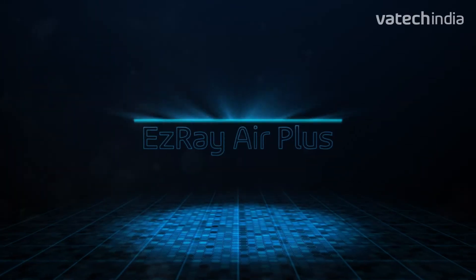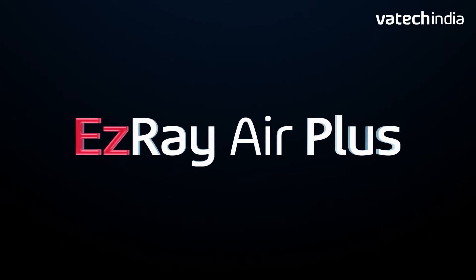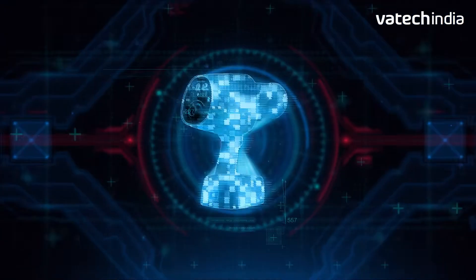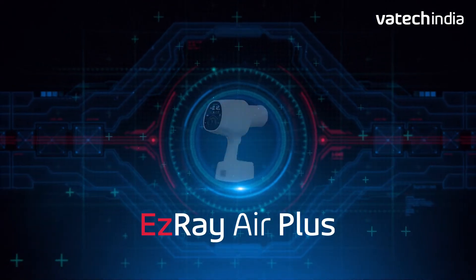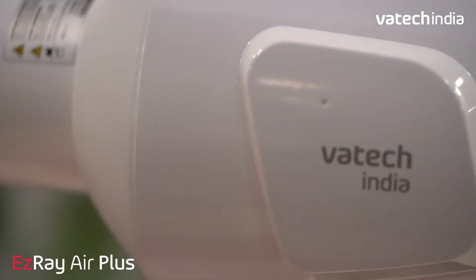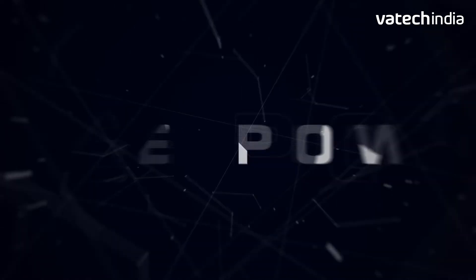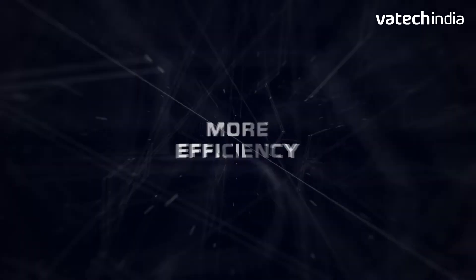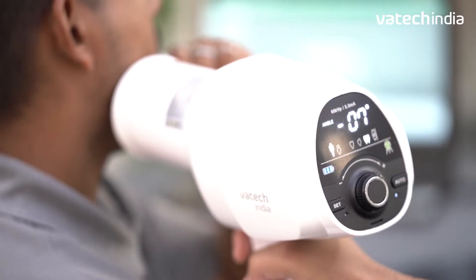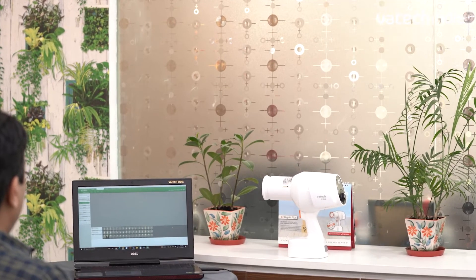EZ-Ray Air has created a revolution in the lightweight portable X-Ray unit segment. The all-new EZ-Ray Air Plus from Vatak India comes with the concept of power of more — with more power, more efficiency, more safety. The most smart unit not only assists clinicians in digital dental practice, but also adds smart looks to the clinic infrastructure.